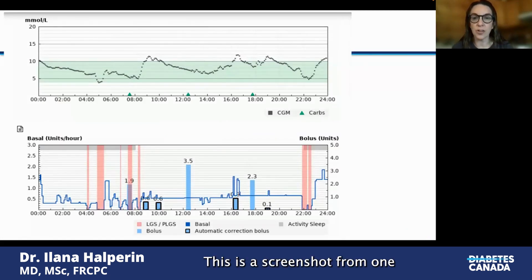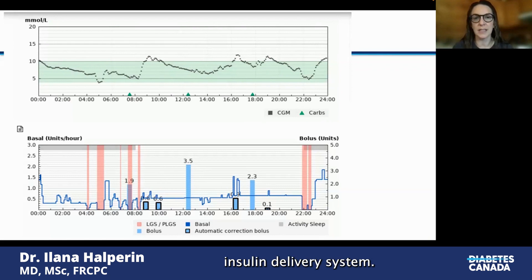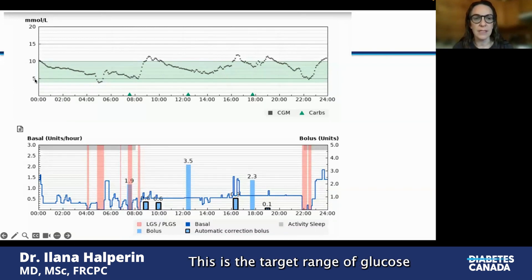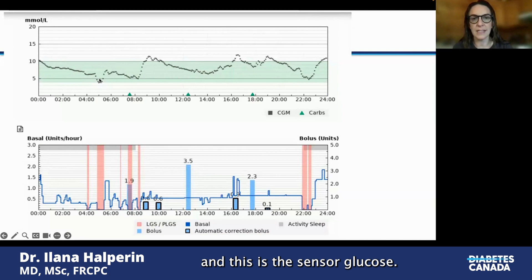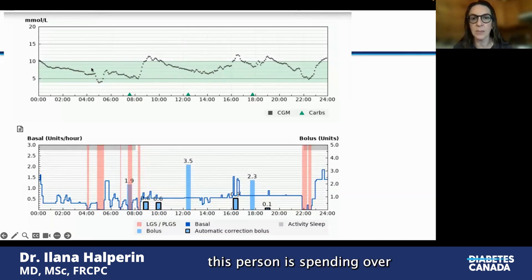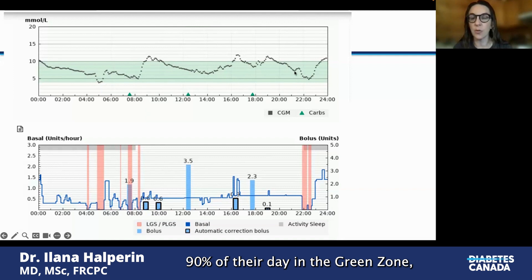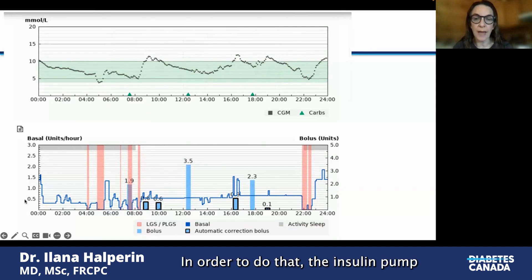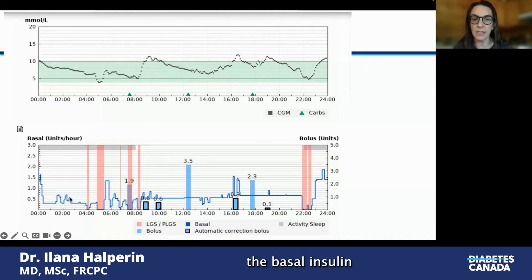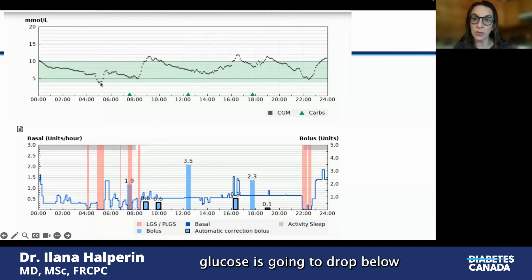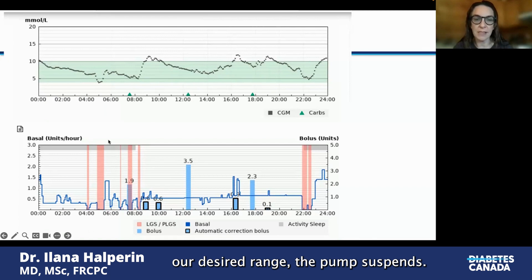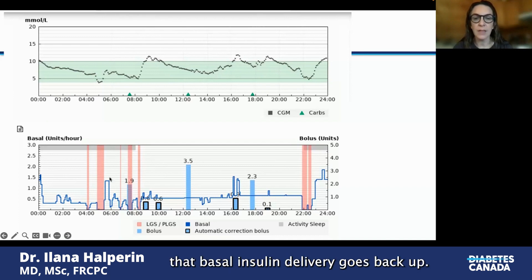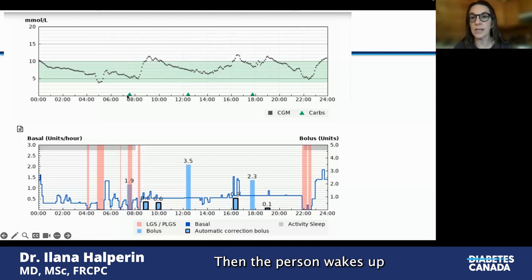This is a screenshot from one of my patients using a commercial automated insulin delivery system. The target range of glucose is between four and ten, and this is the sensor glucose. You can see that this person is spending over 90% of their day in the green zone — not too high, not too low. In order to do that, the insulin pump is continually adjusting the basal insulin. When it looks like the person's glucose is going to drop below the desired range, the pump suspends — that's what these pink lines are. As glucose levels start to climb, the basal insulin delivery goes back up. Then the person wakes up and decides to eat breakfast.